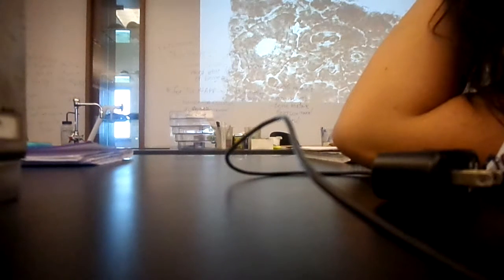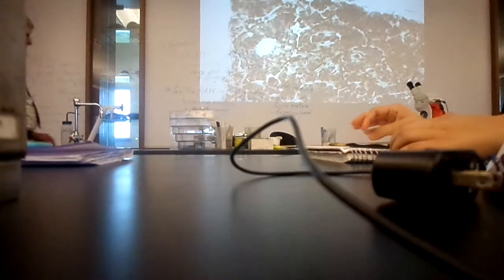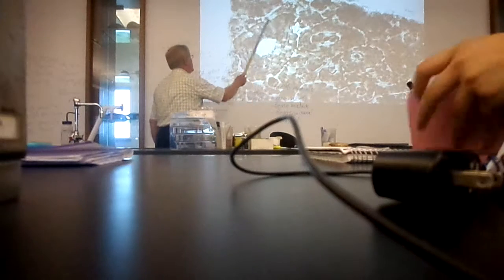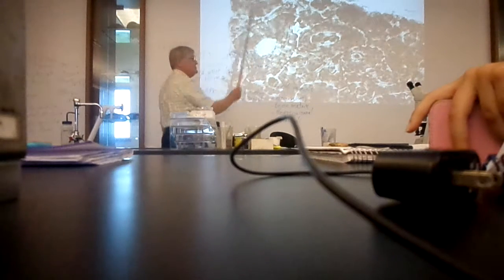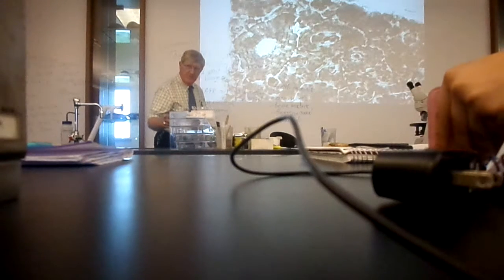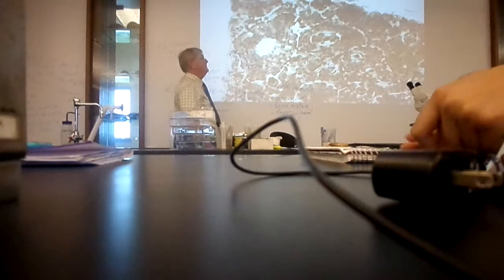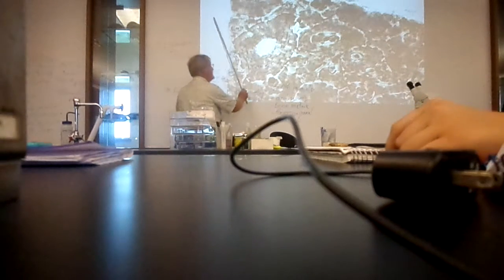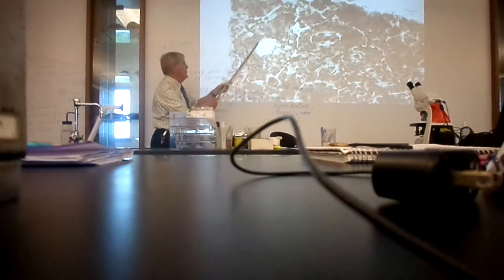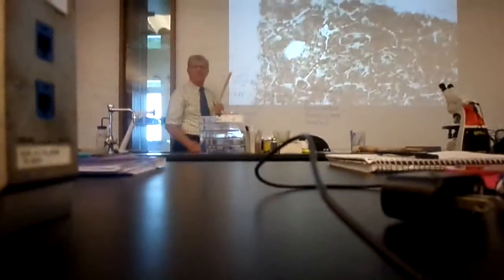Is the whole thing the matrix? This whole circular object is one osteon, or Haversian system. Okay? And then, was that your question? Bone matrix is everything that you see here except for this hole and those black things, whether they're the lines or the ovals.